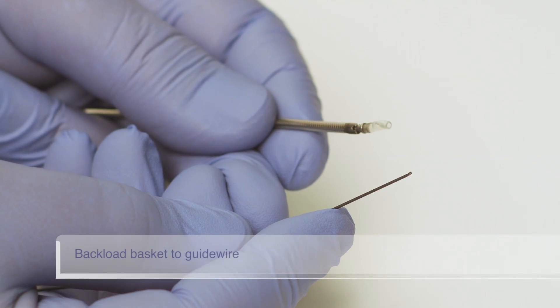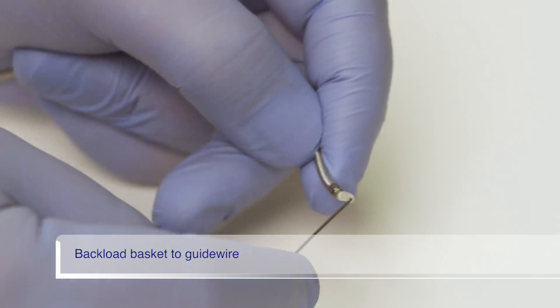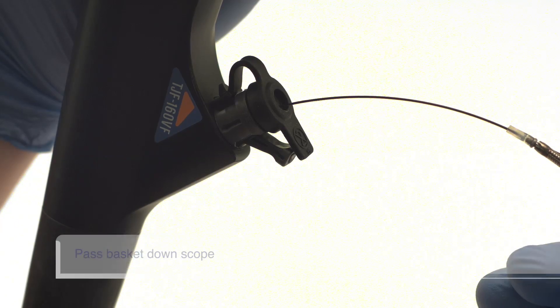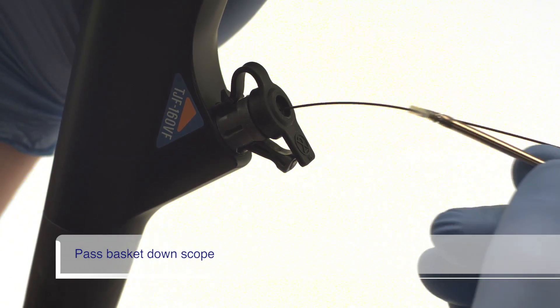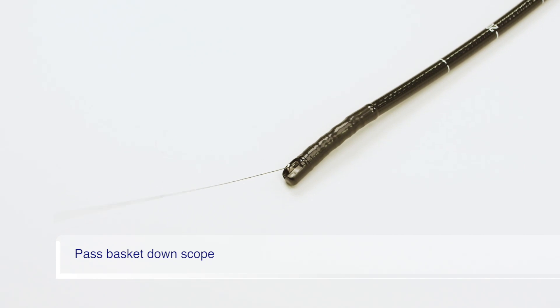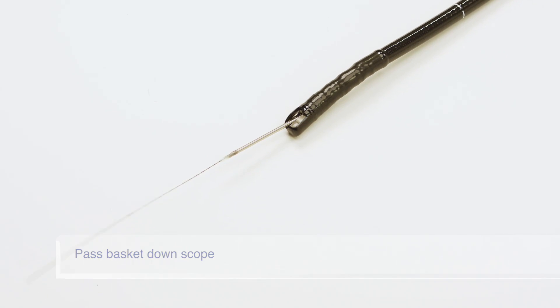Backload the distally wire-guided basket tip onto a .035 inch or smaller guide wire. Pass the basket down the scope along the guide wire into the patient's duct. The distally wire-guided tip enables the basket to cannulate the duct by following the guide wire.